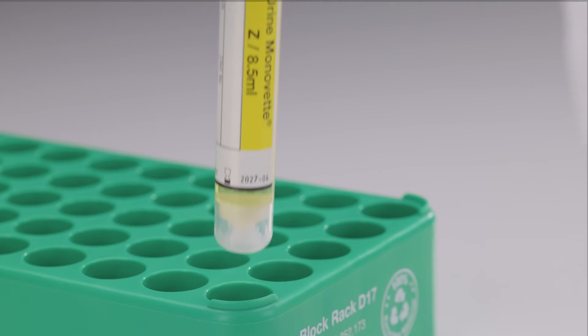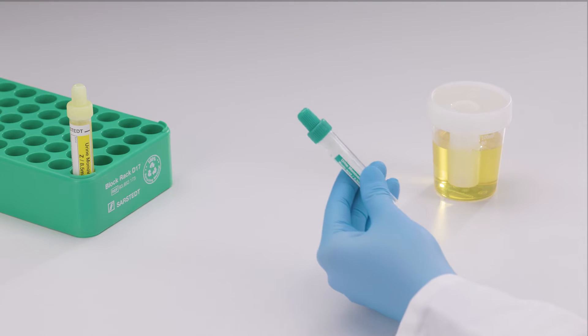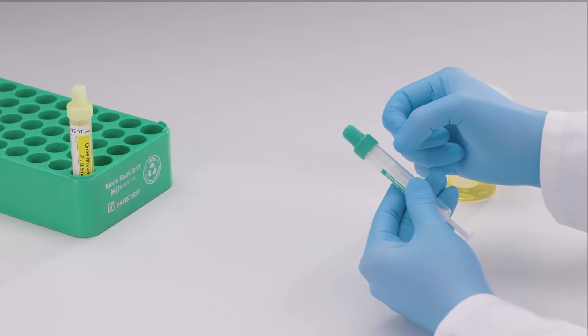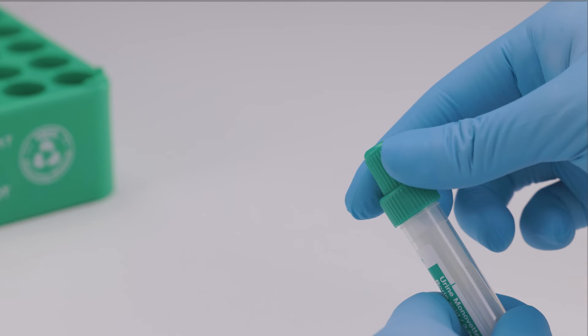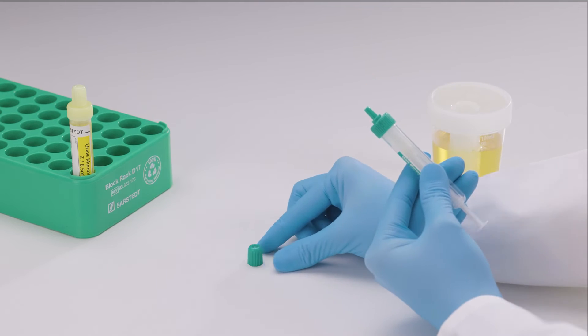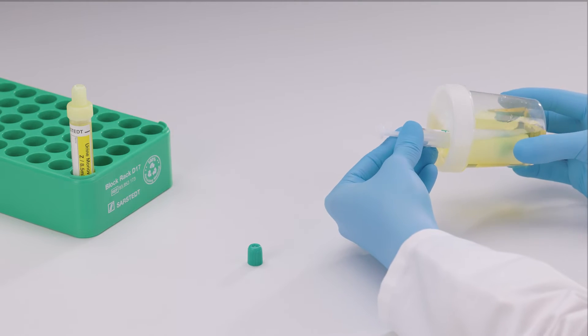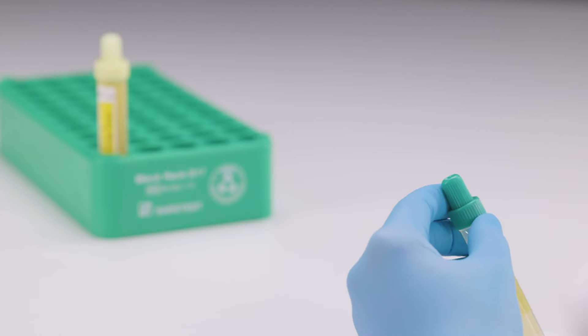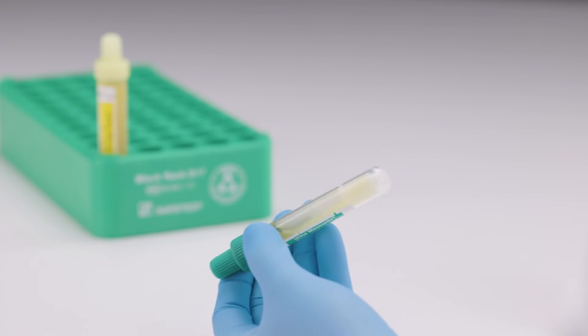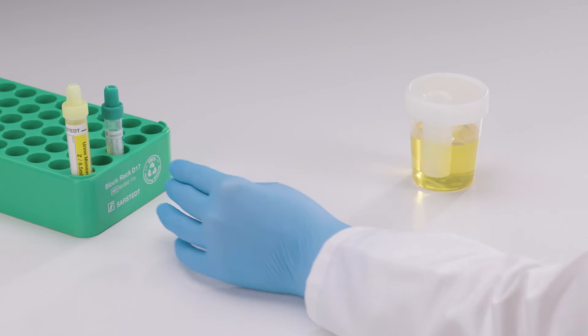If required, proceed with a urine MonoVet boric acid. Hold the urine MonoVet upright with the tip pointing upwards. Tap the urine MonoVet twice to settle the boric acid at the bottom of the tube. Remove the stopper from the tip of the urine MonoVet and repeat the same process as previously. Invert the urine MonoVet boric acid around five times or until the boric acid is completely dissolved.